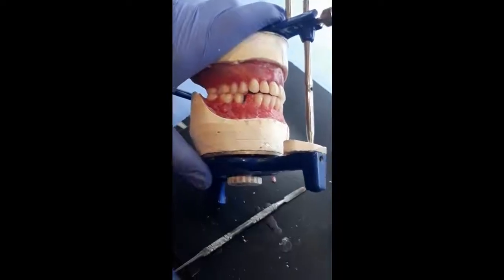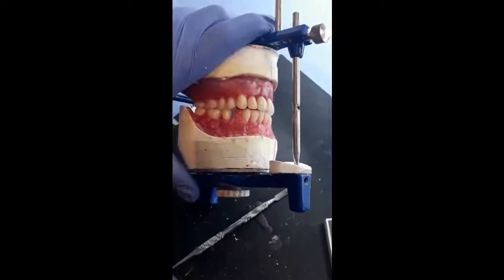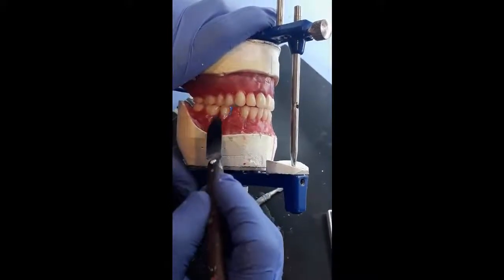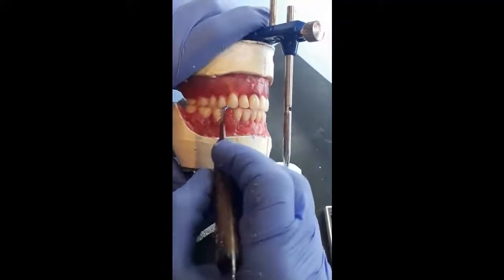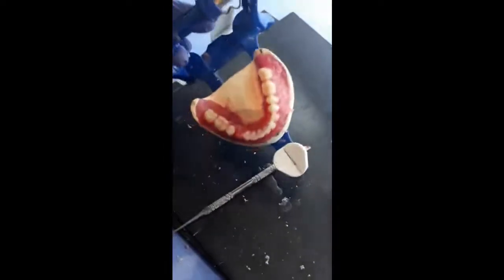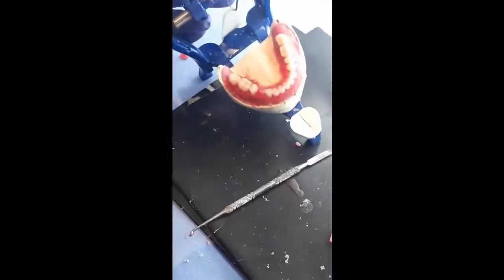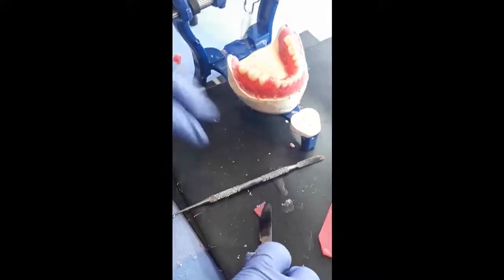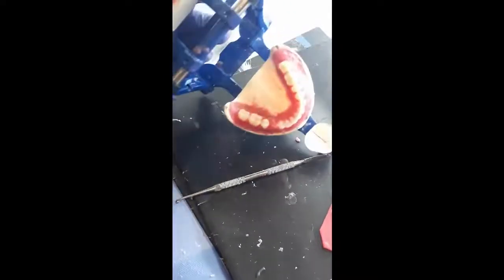maxillary premolars. We fix it in its place by melting the wax around it. Make the maximum intercuspation. Now I need to fix the second premolar in its position securely, so it will not move.